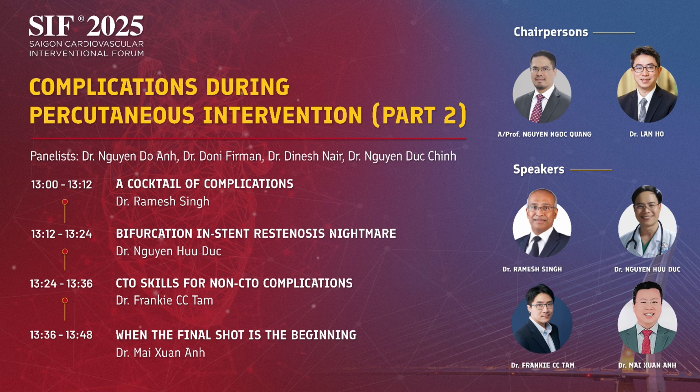Normally I inflate the balloon slowly, and we can see on the DSA that it is too big a balloon, right? I cannot stop my colleagues. Yeah, I think it happens, especially at midnight during primary PCI or a prolonged procedure. Thank you.